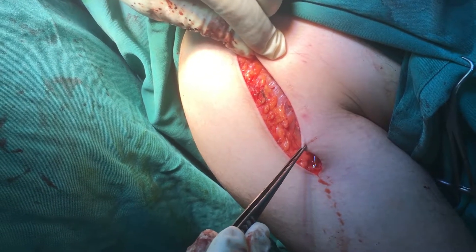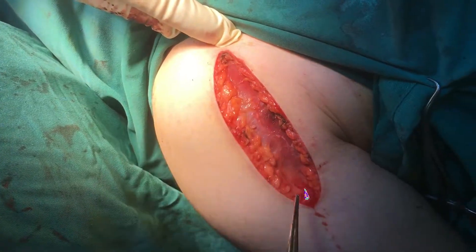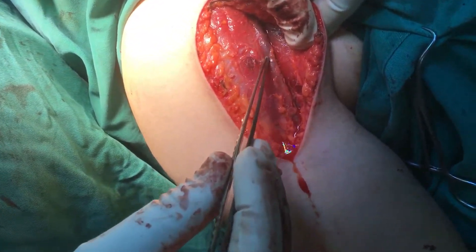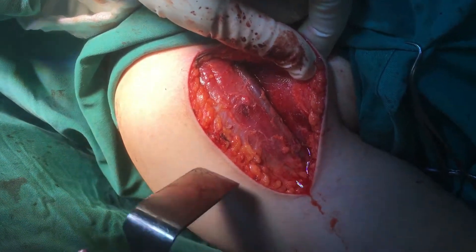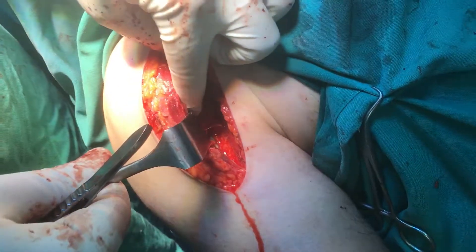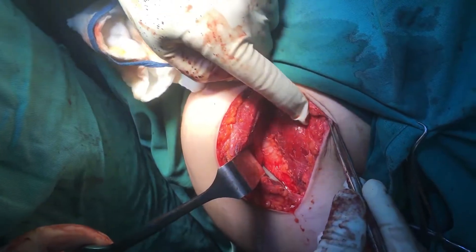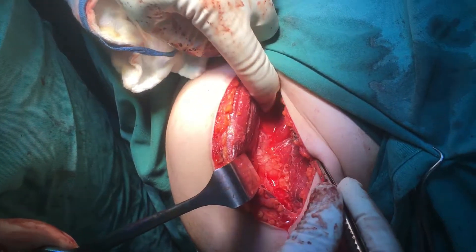This is a case for the deltopectoral approach. We start our incision from the coracoid to the upper part of the arm, deltoid insertion. This is skin subcutaneous dissection until we reach the cephalic vein. This is the deltoid and this is the pectoralis major muscle. If we flip the deltoid to the lateral side and the pectoralis to the medial side, this is the pectoralis and we find here the clavipectoral fascia.